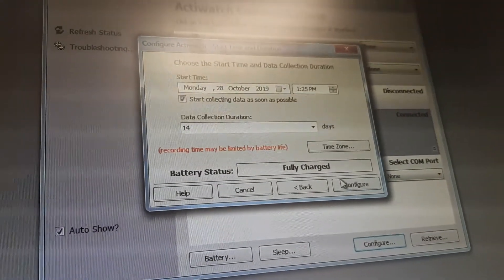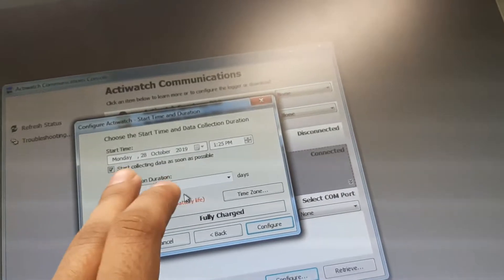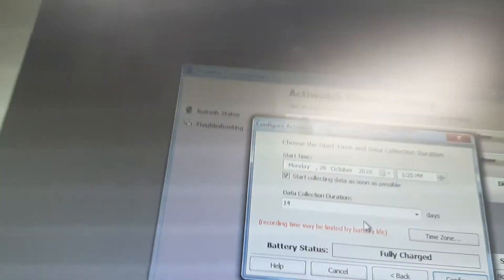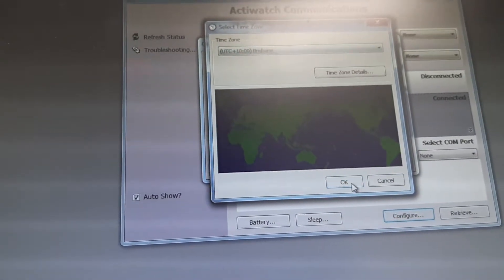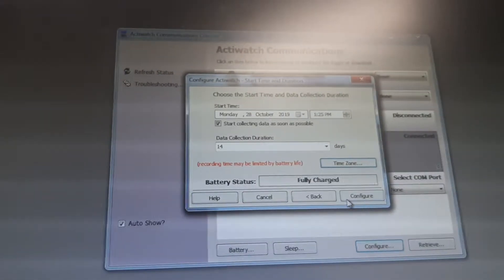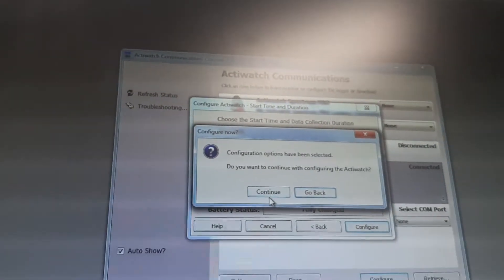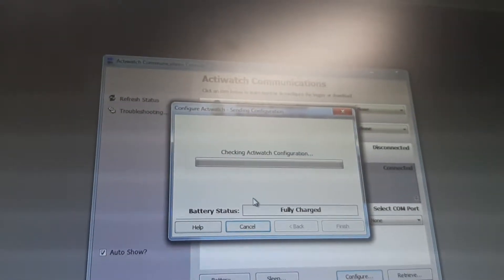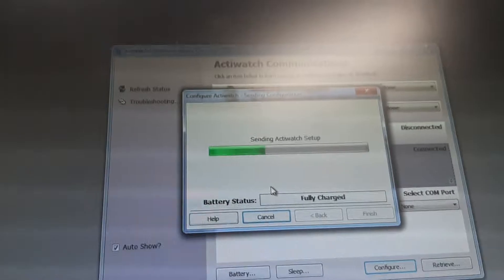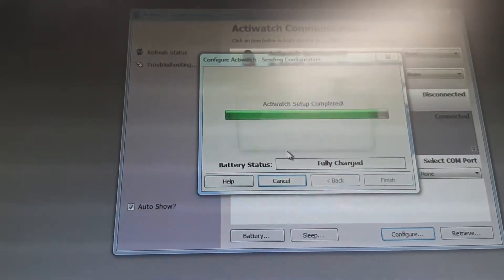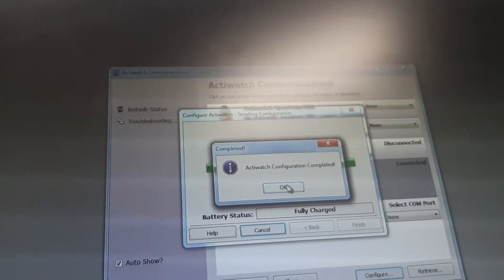Clicking Next. The start option is set to collect data as soon as possible, so it will start collecting at 1:25 — about two minutes from now. The battery is fully charged. I click Configure, confirm that I want to continue configuring the Actigraph, and it begins configuring. It verifies the sleep mode and the Actigraph configuration is completed.